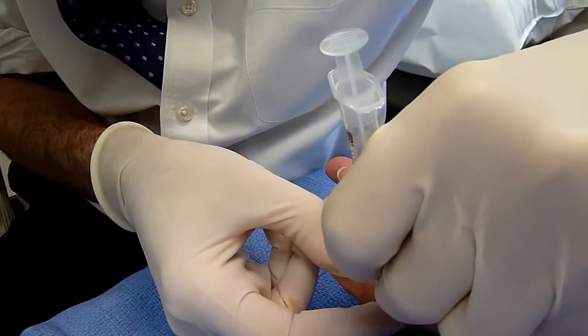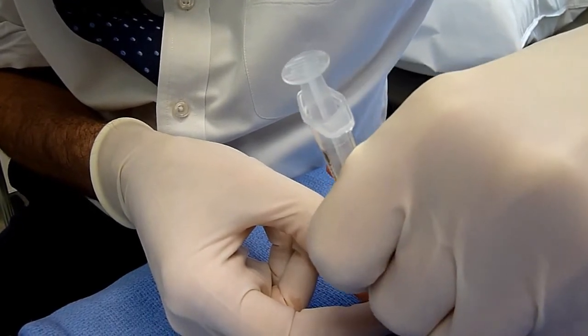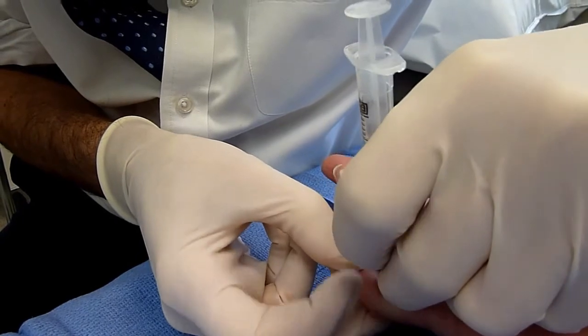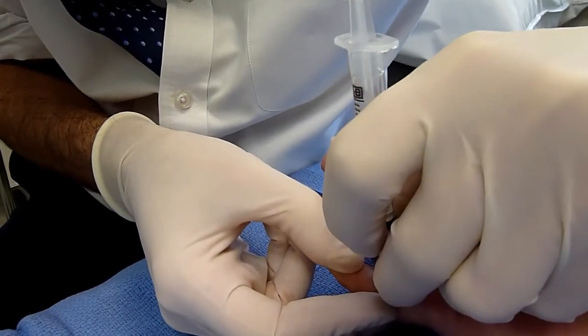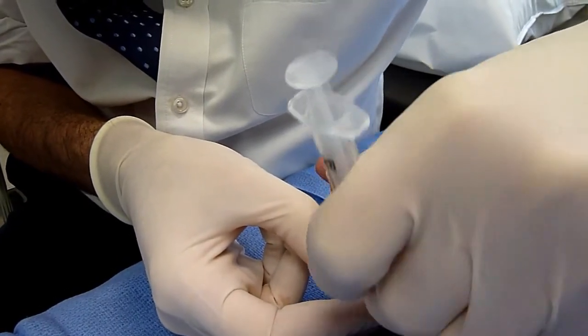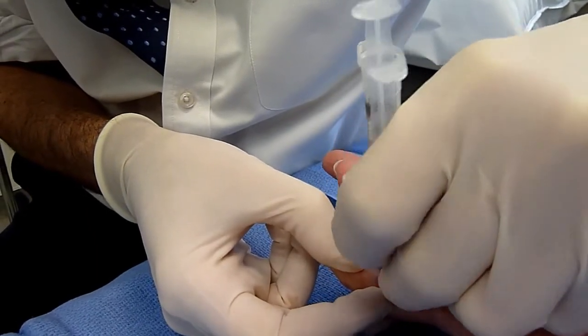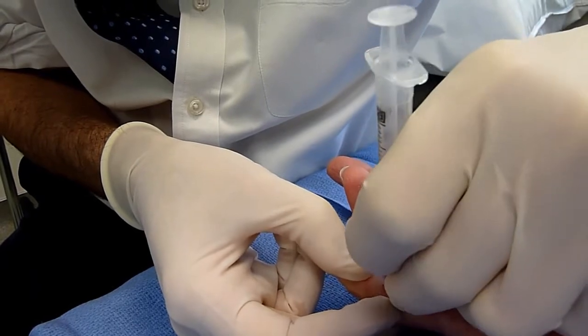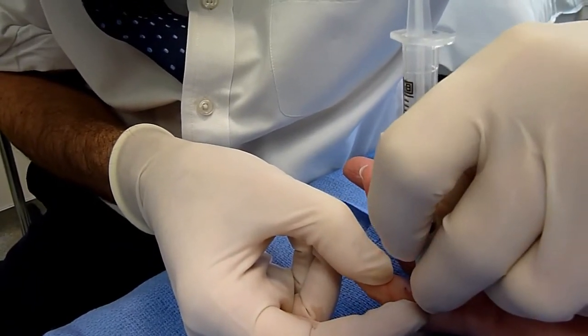Excellent. I tried to have my regular doctor do this on me, and all he did was poke at it. And I said, you didn't watch my video. They don't poke at it. They swipe. Well, Charlie was a poker when I watched him do it. I don't like poking. I like what you're doing better. It lets me control the depth.